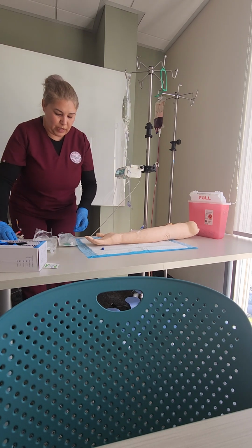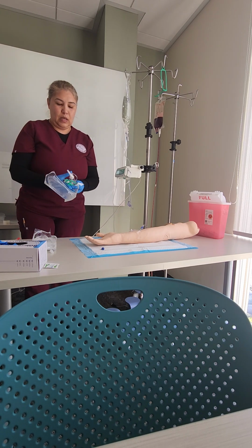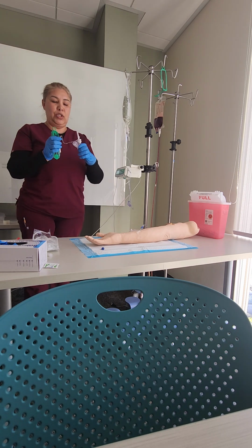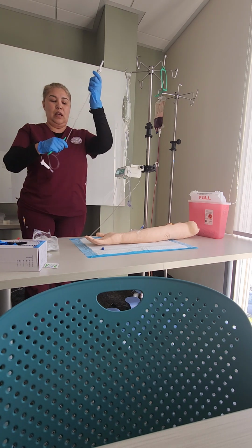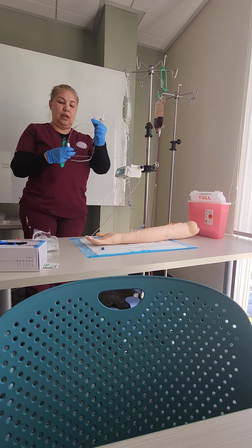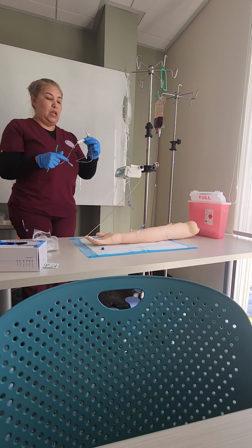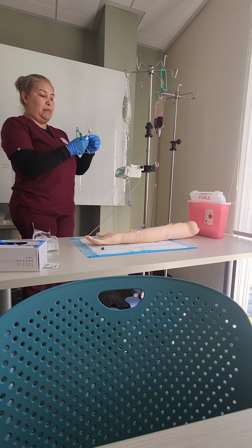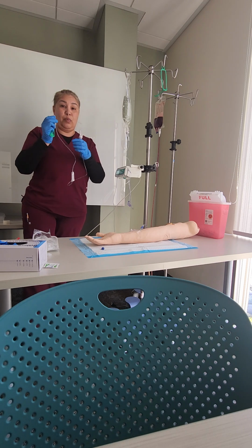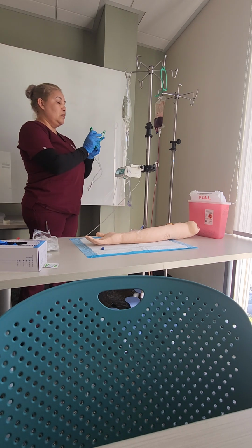Now what I'm going to do is open up my supplies for my piggyback. Again, I want to make sure I maintain sterility. I want to make sure that my tubing looks appropriate, that there are no kinks, that it is not ripped. I want to make sure that it is clamped. Okay. And this one's still brand new. It has a cap, still fully sterile.